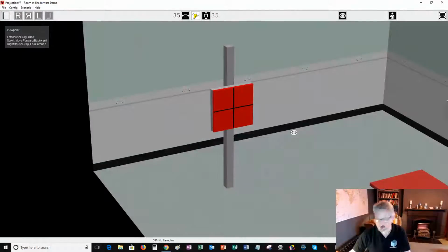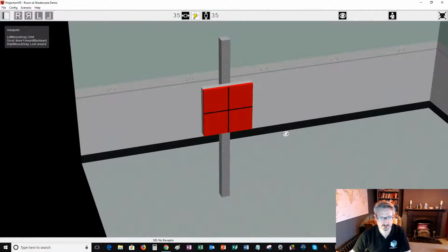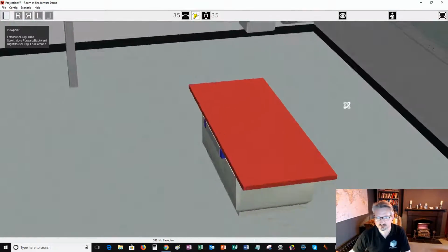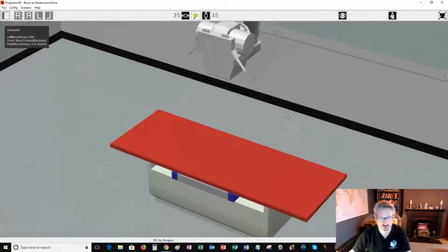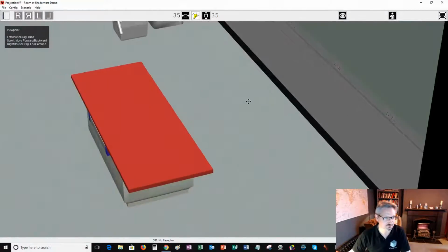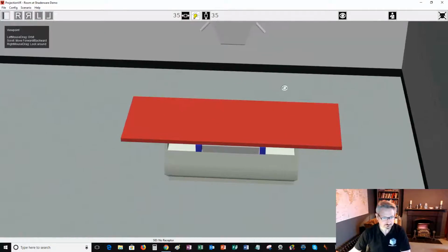So in combination, left mouse button, scroll wheel, and right mouse button, I can always pay attention to any particular part of the X-ray room that I want to. It just takes me a little while to get it in the middle. So I'm happy that when I spin round, I'm seeing it from different angles. Yeah, that's very important when you're trying to judge a position and trying to judge your collimation and things.